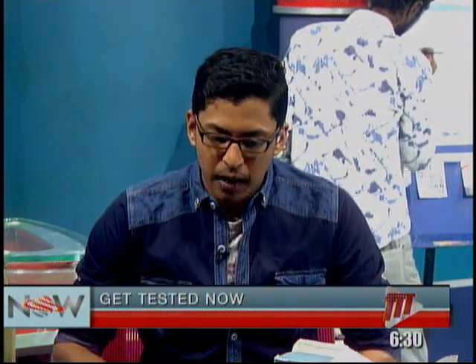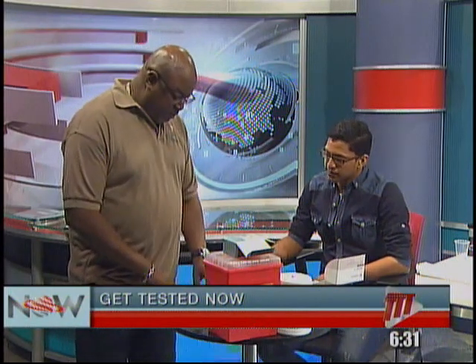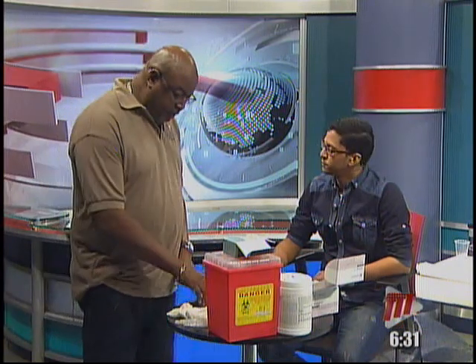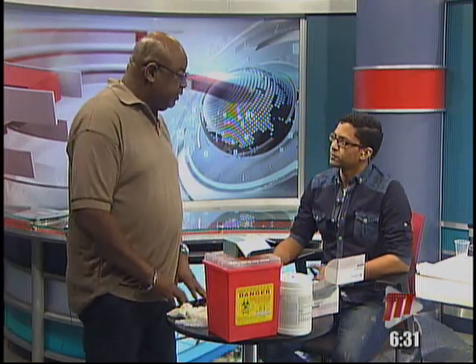I have with me Moses, a gentleman here who is going to do a test for me this morning, and we're going to explain the process of doing the test because it is important. So first of all, it's not a difficult process. No, it's not. It's a finger prick that detects HIV antibodies when placed on the test strips.